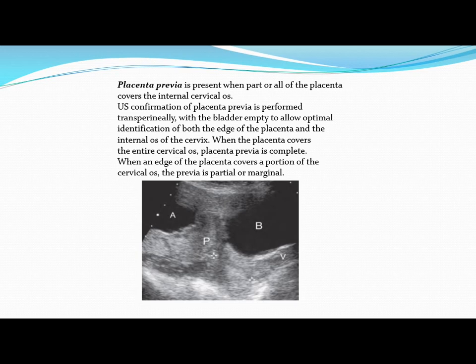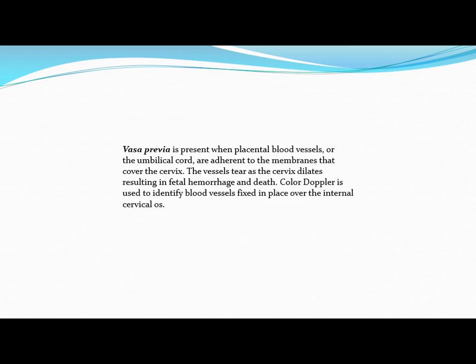Usually after 32 weeks, you can make up your mind. This will not ascend anymore. Cesarean.